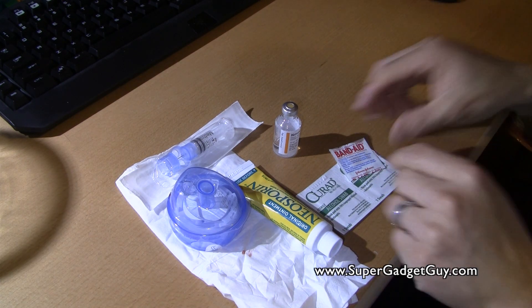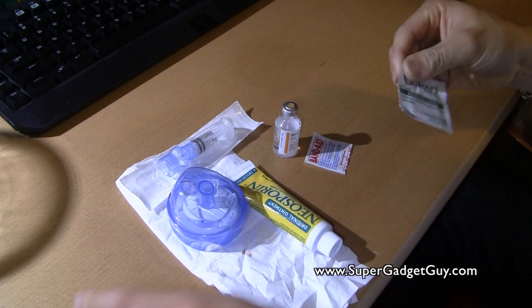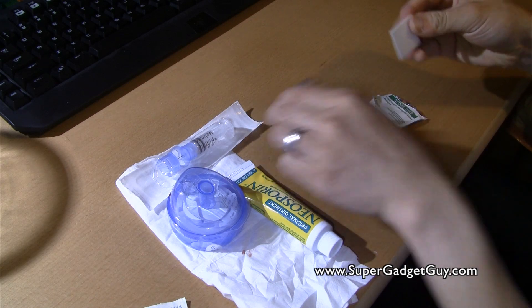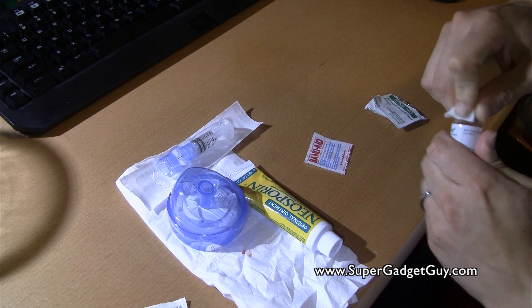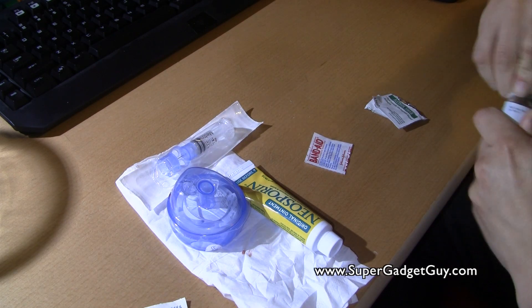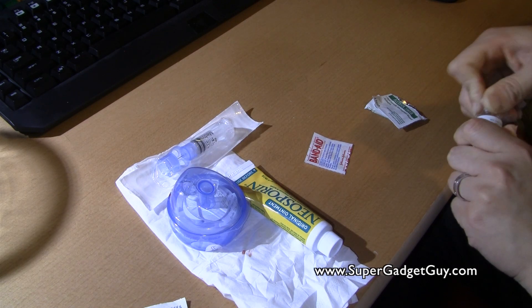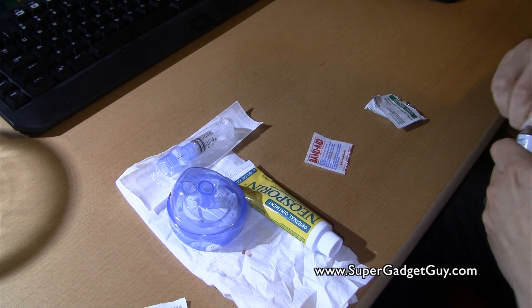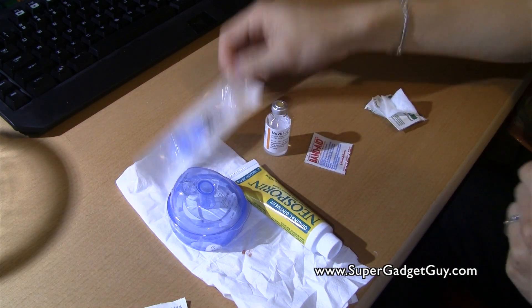First thing I do is take one of the alcohol pads and wipe the top of the insulin bottle. Make sure you wash your hands before you do it — you want to minimize the chance of infection, because when you're diabetic you're already at higher risk for getting an infection. And when you get infected, your blood sugar goes all out of whack from your normal pattern.